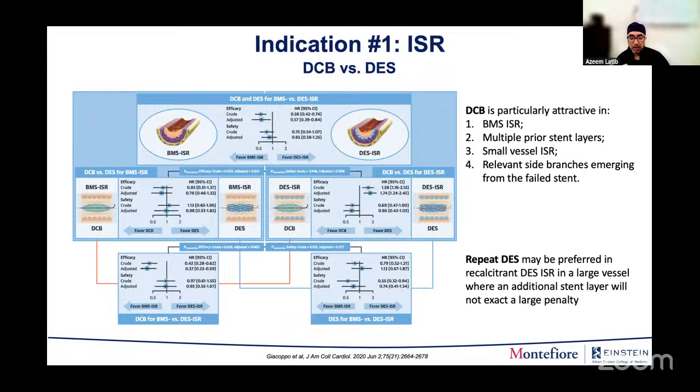Okay. Now, a lot of us who are in the field have a little bit of issue with some of these studies. A couple of noteworthy things were whether it was first restenosis versus a second or third restenosis. These were not matched or were not taken into the randomization.